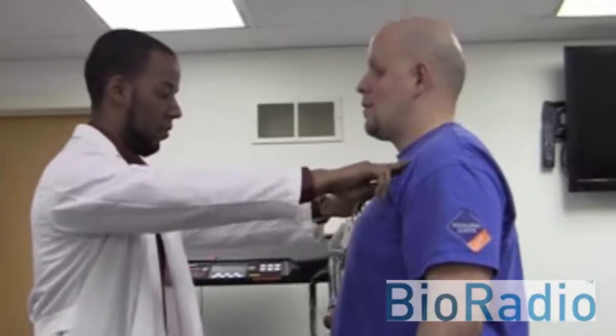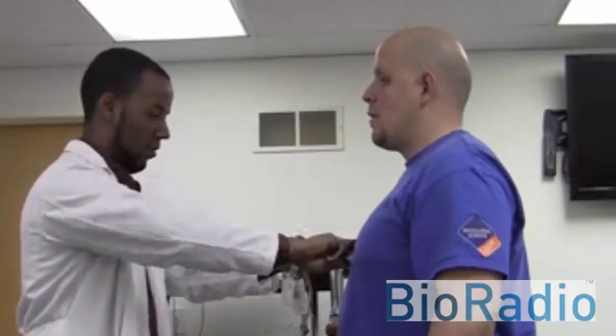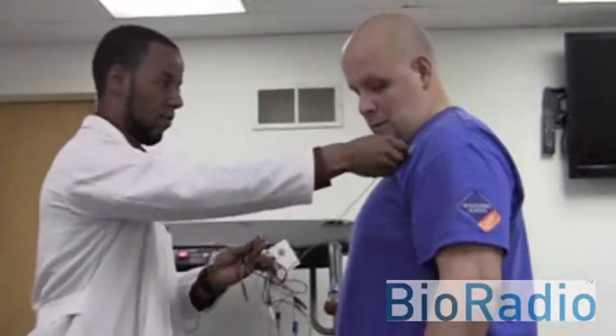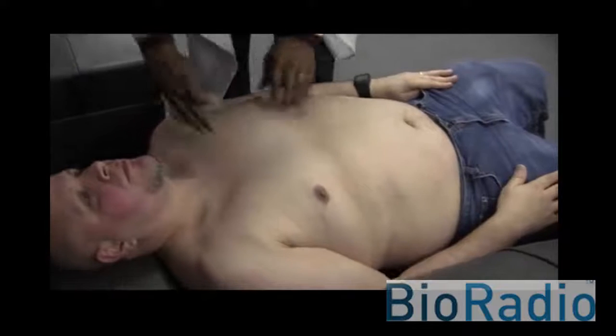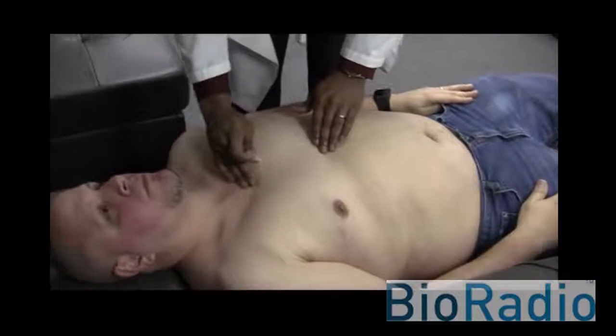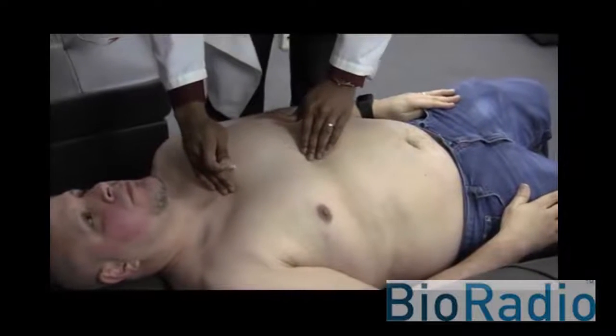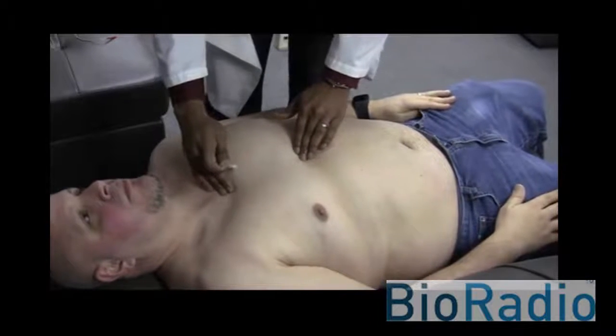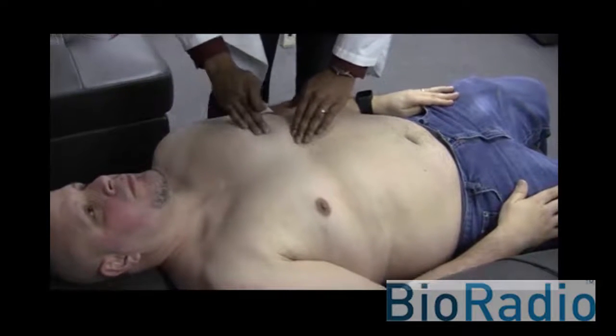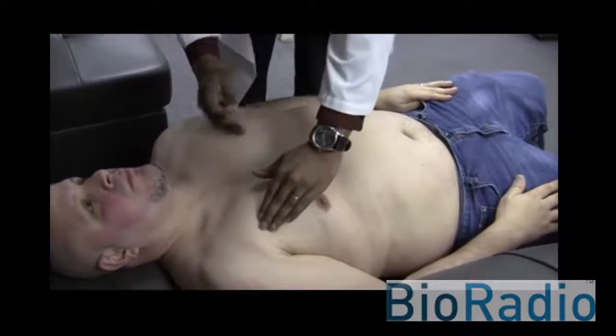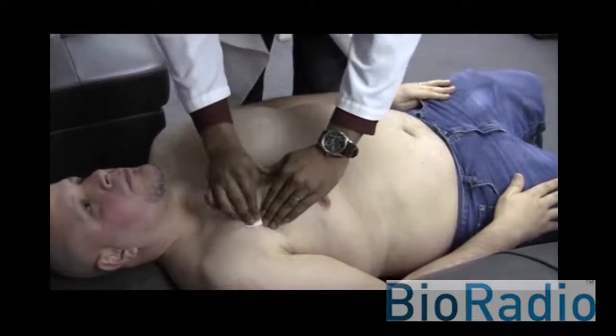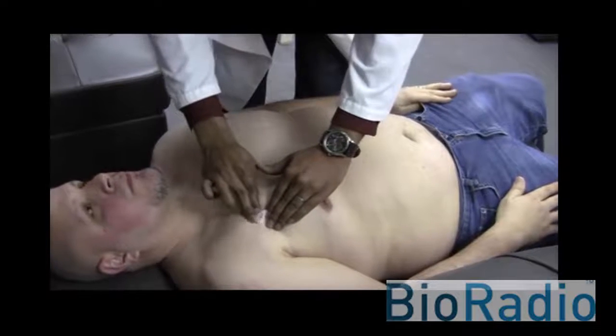Begin by explaining the procedure. To get the best signal, proper preparation of the skin, such as shaving, cleaning the skin, and landmarking the areas prior to adding the electrodes provides an optimal environment for data acquisition.